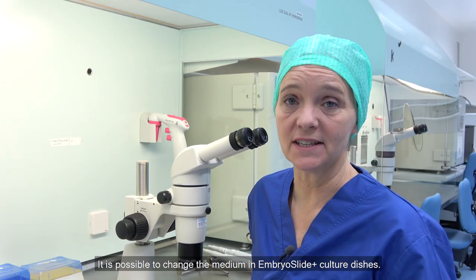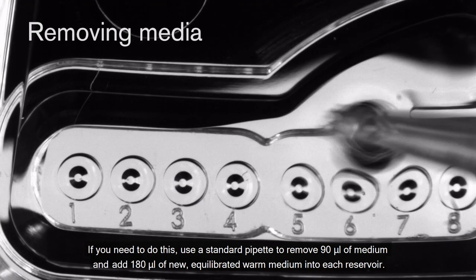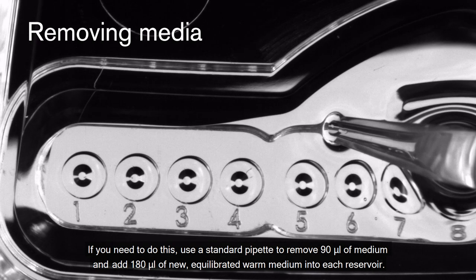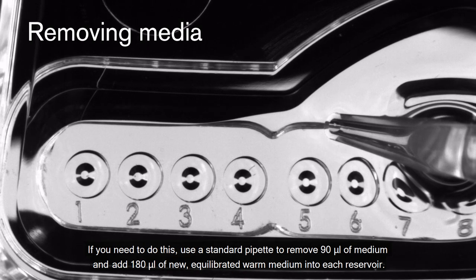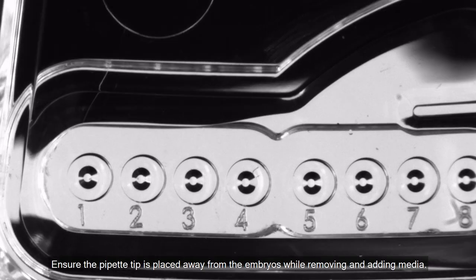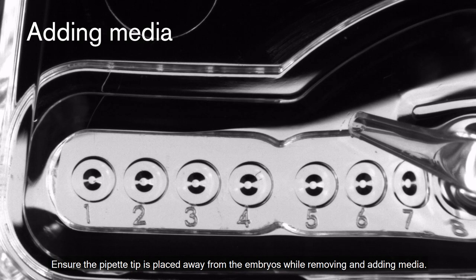It is possible to change the media in the EmbryoScope Plus culture dishes. Add 180 µL of new equilibrated warm medium into each reservoir. Ensure the pipette tip is placed away from the embryos while removing and adding media.